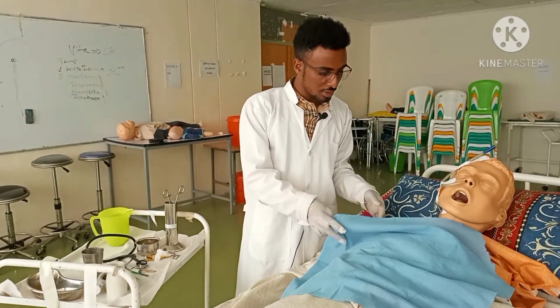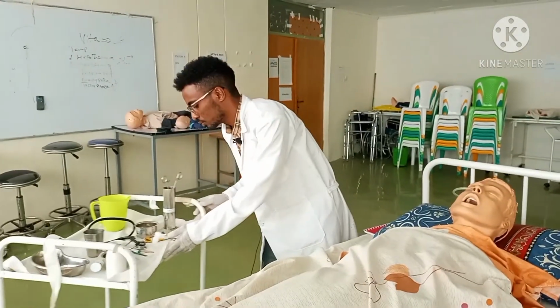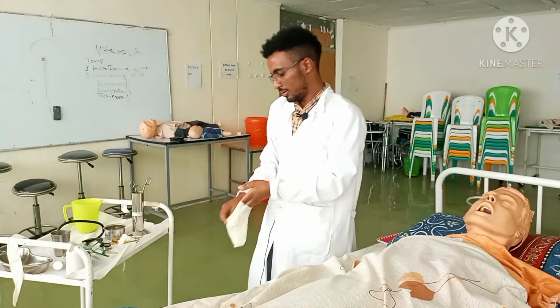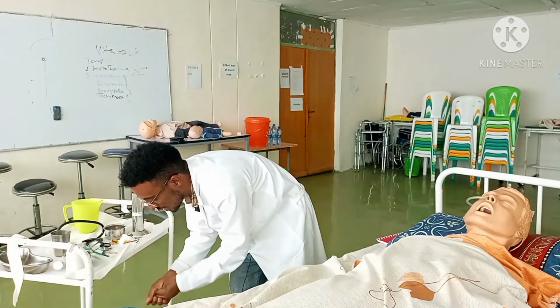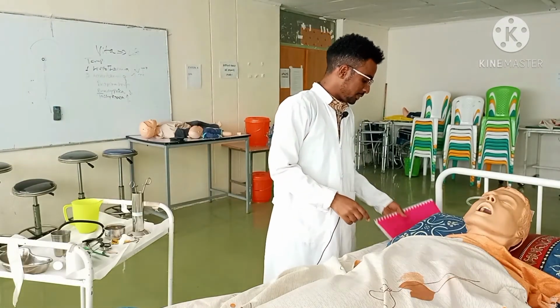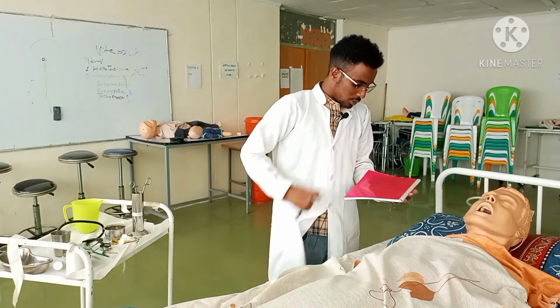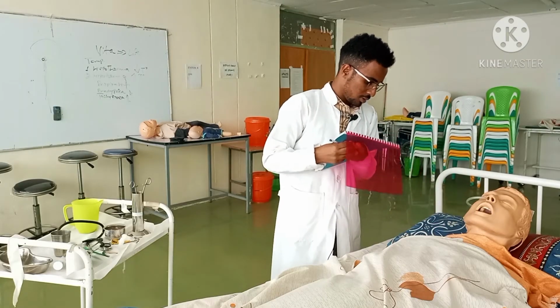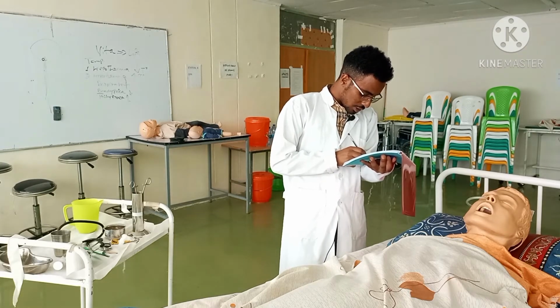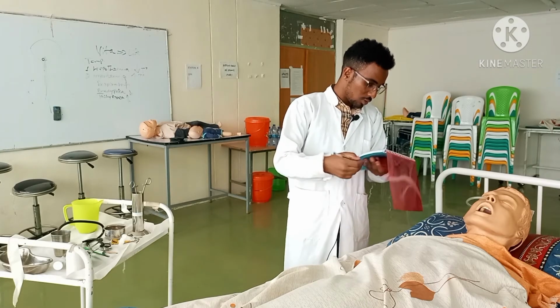Next, you have to reposition your patient. Next, you have to return used equipment. And then you have to remove your glove. Wash your hands or use alcohol hand rub. Then document what you have done. While documenting, you may document the size of the nasogastric tube, the time of insertion, purpose of insertion, any patient reaction, as well as any gastric content you have observed.